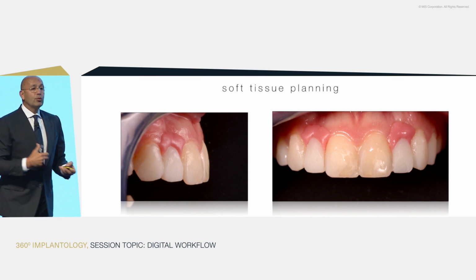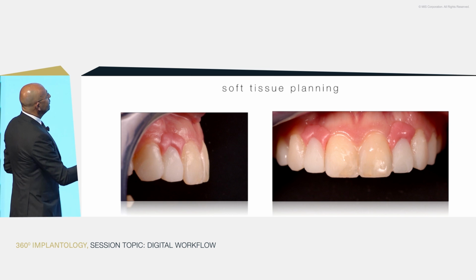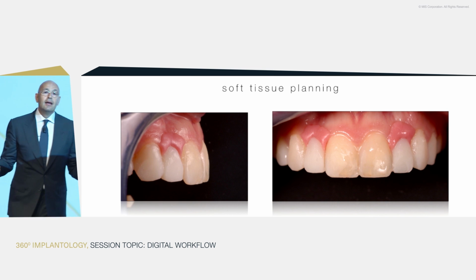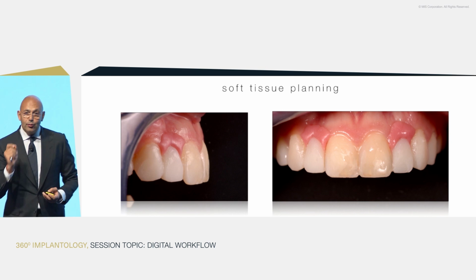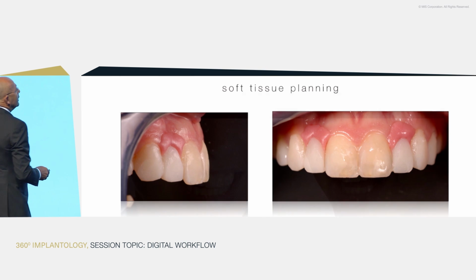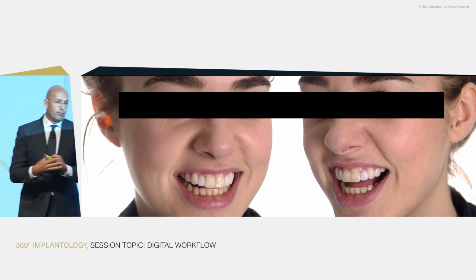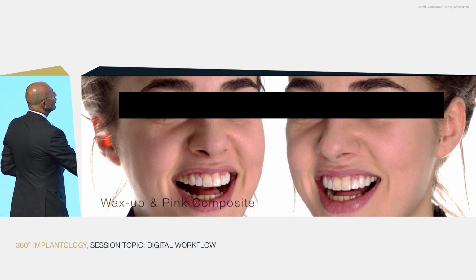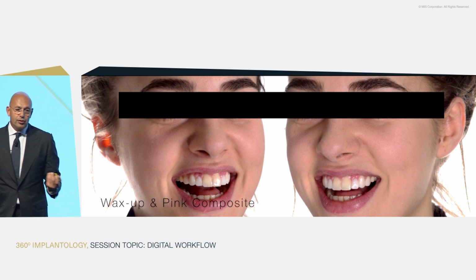So this is what I would ask from my surgeon to fill up besides placing the implant, so that the design that I thought to deliver to the patient would be perfectly the way I want it to be. So after this is what we see. The color is different because we'll be doing very, very thin veneers over the centrals. This is just a try-in. Now with the pink, so the patient can have a rough idea on what's going on.